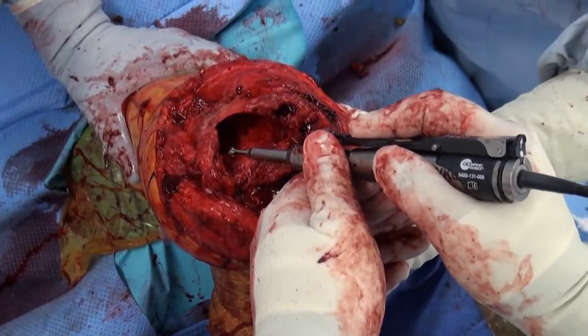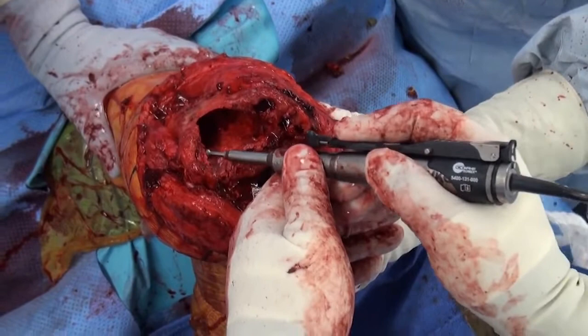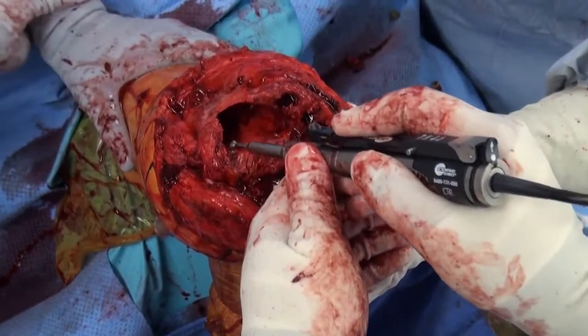As the cone is inserted further and further into the host bone, a decision must then be made on placement of the femoral trial and the desired level of establishing the new joint line. Additional work is being done here with the burr to allow further proximal placement of the large cone, with irrigation of the bone as the burring steps are accomplished.